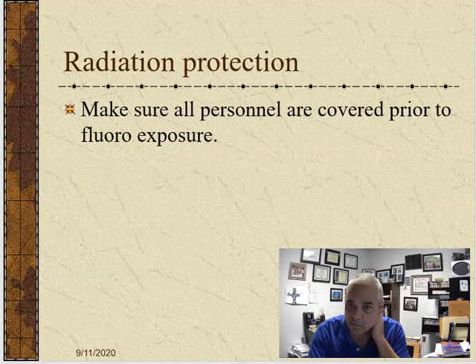Easy breezy. Make sure everybody's covered before you start fluoro, and this is your responsibility. I mean, not as a student, but when you're a technologist one of these days, that's part of your scope, is to make sure that during fluoro procedures you look around and do a head count and make an announcement. Is everybody wearing lead or behind some lead? Standing behind your buddy is, if you don't have lead on yourself, you can just stand behind somebody that does, and that counts as shielding.